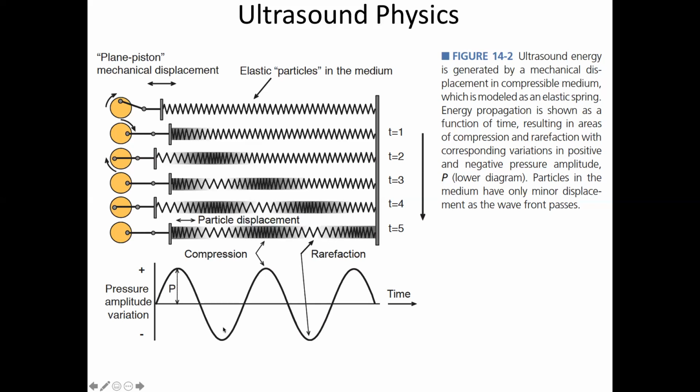This can be described, mostly described, by one solution for the wave equation, which is a sine wave. It's a nice solution. However, sine waves probably, as Jerry says, don't occur in nature because they're infinitely differentiable, right? So it's a nice approximation, but it's probably not what's actually in there. It's close.